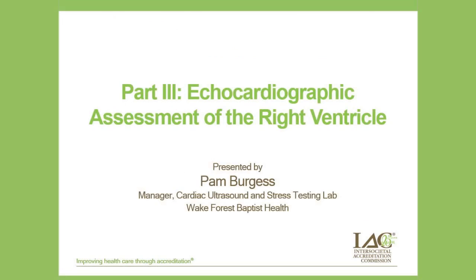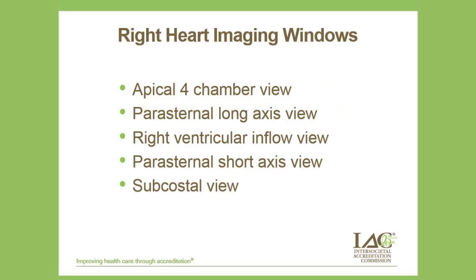My portion of the presentation will include the echocardiographic assessment of the right ventricle. We as sonographers and echocardiographers have always focused on the left ventricle, so a lot of the measurements I'm going to be going over are measurements that maybe in the past you performed on the left ventricle, but now we're adapting them to the right ventricle. The views are essentially going to be a review of what we do already, so that's included in our basic protocol. So with the measurements, just look at this as an extension of your basic protocol for a right heart patient.